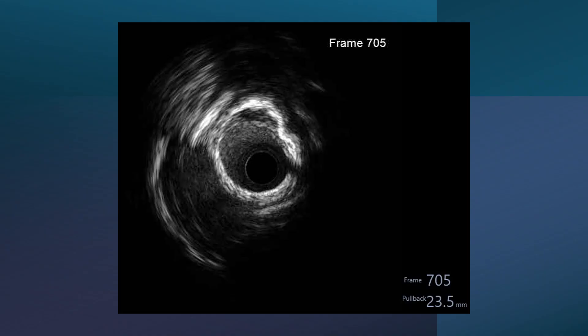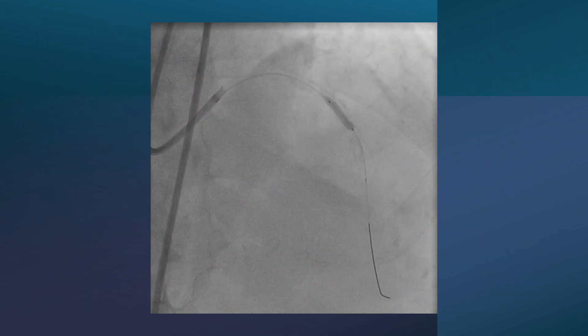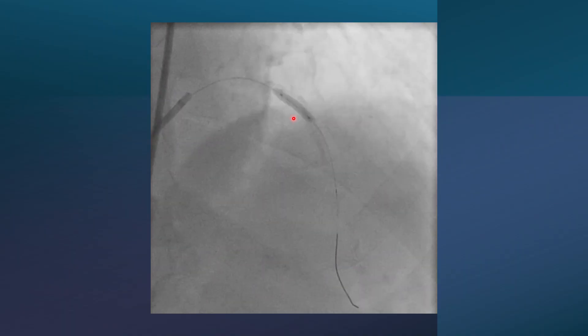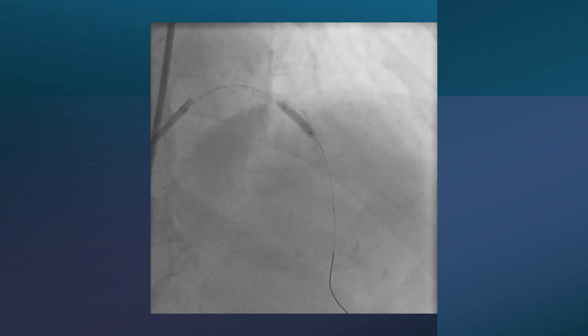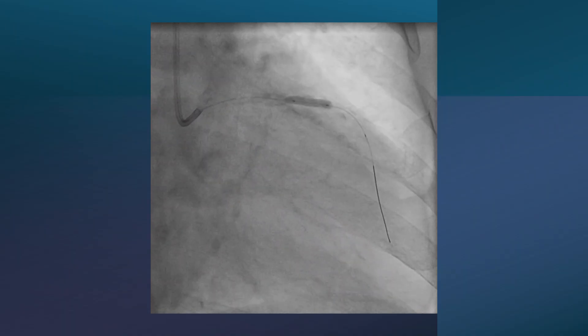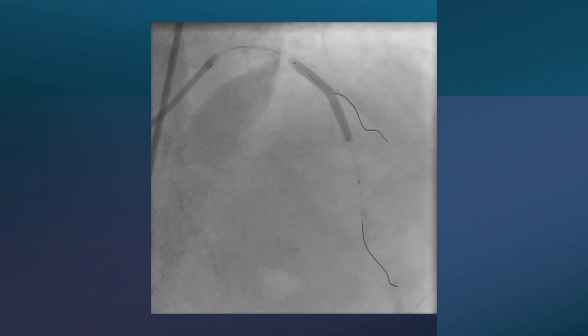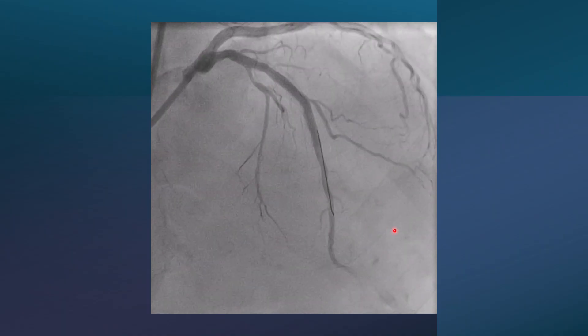However, we must take another criterion into consideration: the length of this calcified segment. If we measure it, it is even less than 3 millimeters. So, with the calcification being less than 5 mm in length and not very circular apart from one point, we decided this patient did not need debulking therapy. We went for balloon dilatation using an NC balloon at high pressure. The calcium is far from the balloon, indicating it is deep rather than superficial. We dilated the lesion using NC balloon, taking two orthogonal views to confirm complete dilatation and lesion preparation. Then we stented the lesion, post-dilated, and this is the final result of the first case.